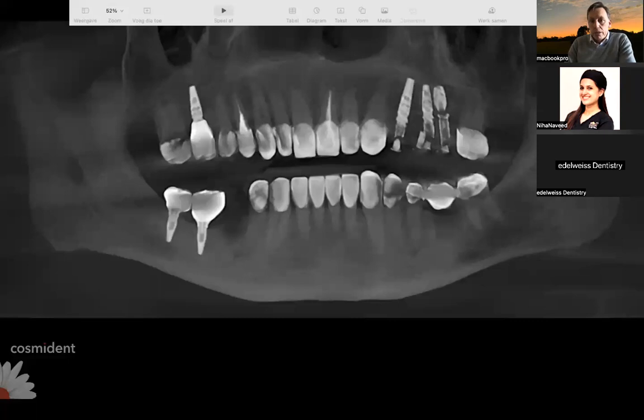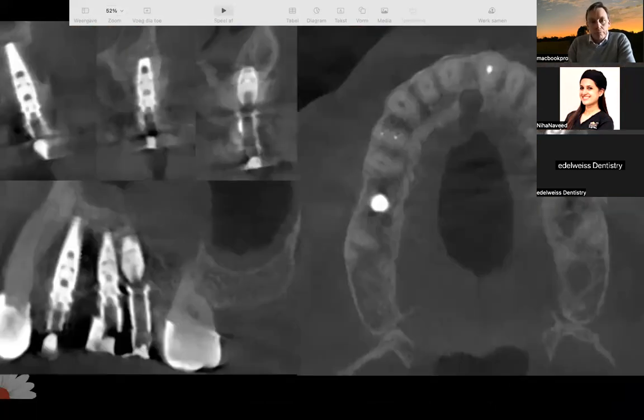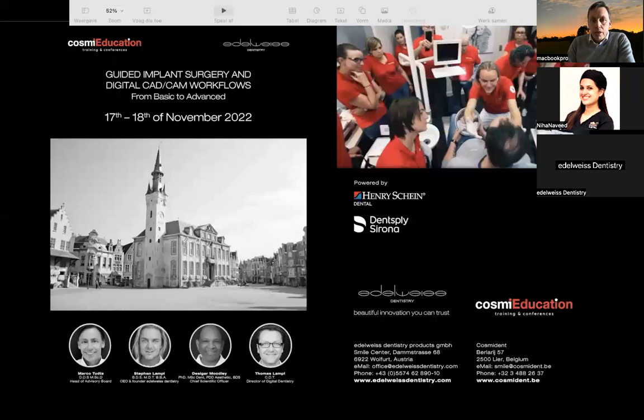And finally, this is the X-ray of the result: the CBCT X-ray after placing the implants and before we did the loading. Here you see the huge defect we had to restore, and you can also see what I restored to the bone. I had to augment a lot of bone to get it done. But here is the result. And now I will let you see the whole procedure, which Stefan and I did on the same day.